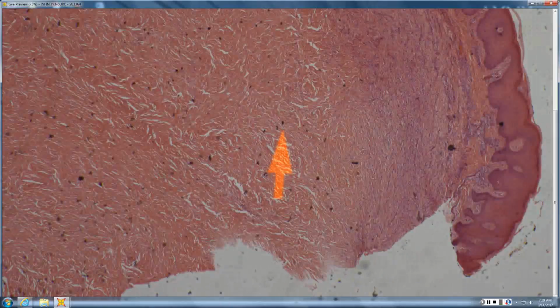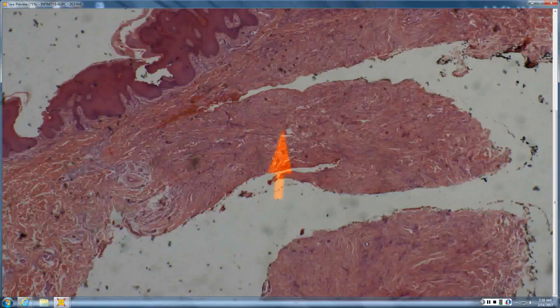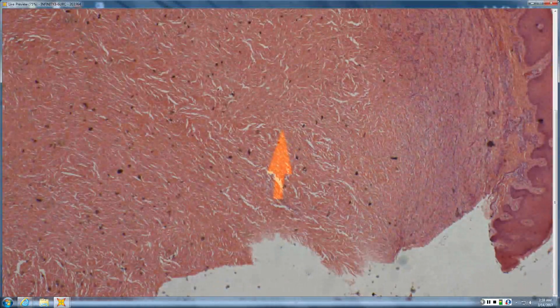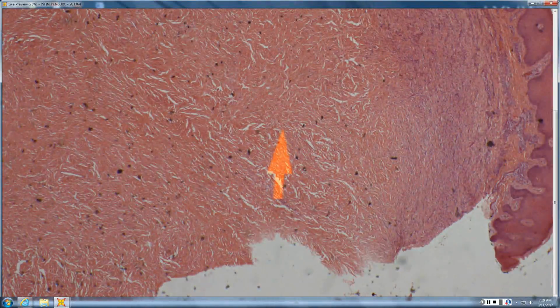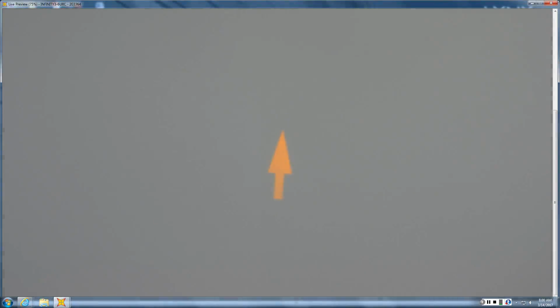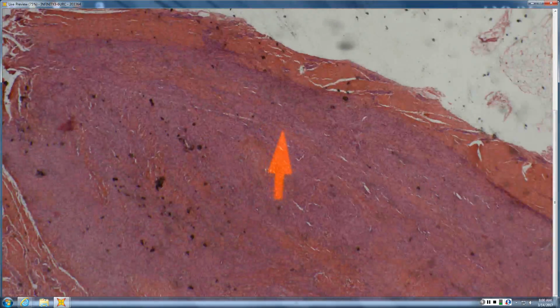Okay. Jess, what do you see here? So mostly this looks pretty sclerotic. Any patterning to it? Reminiscent of any Impressionist paintings? Like Van Gogh's Starry Night. Sclerotic. So sclerotic fibroma, any associations to sclerotic fibroma? Cowden's disease. So it's relevant because of its association with genoderm.